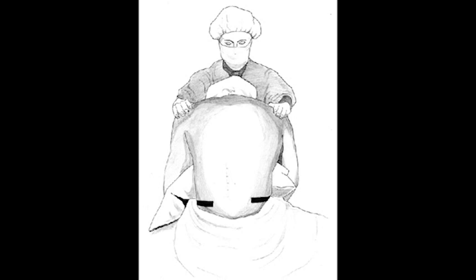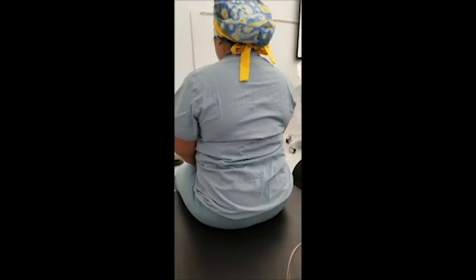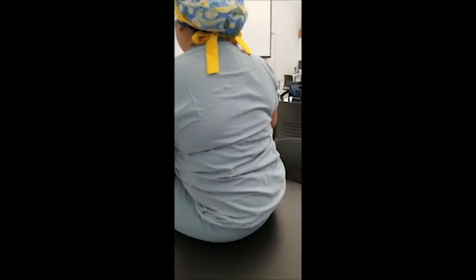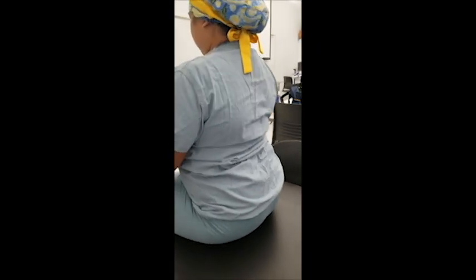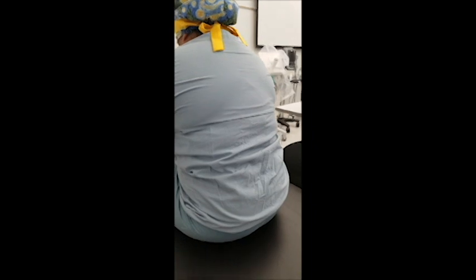Today we will demonstrate placement of an epidural catheter using the midline approach. Educating and counseling the patient on proper positioning will help facilitate a successful epidural placement. Instruct the patient to sit on the side of the bed, knees drawn up, shoulders down and relaxed, and chin to chest. This can be achieved by placing a chair for their feet, hugging a pillow, or sitting Indian style. This helps open up the lumbar spaces.